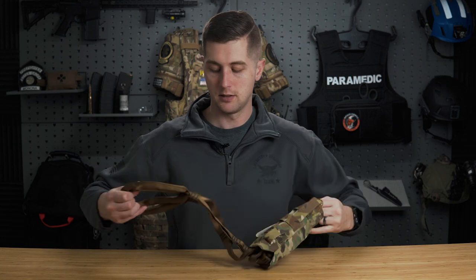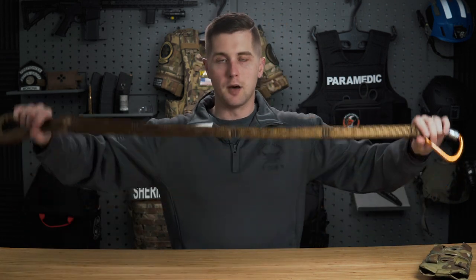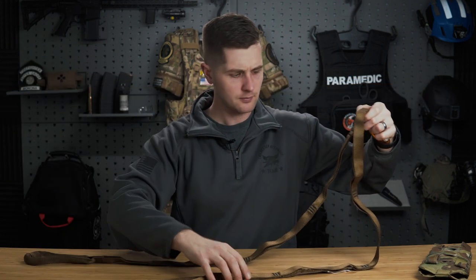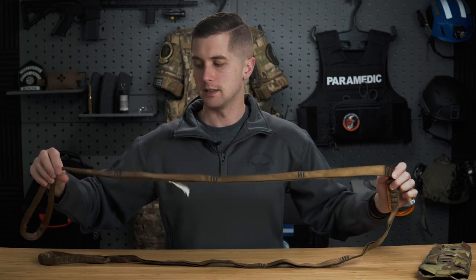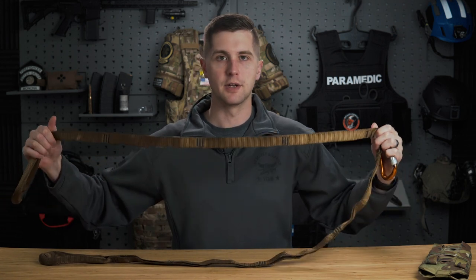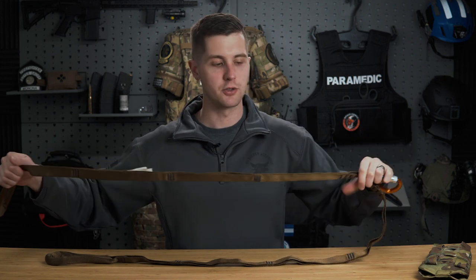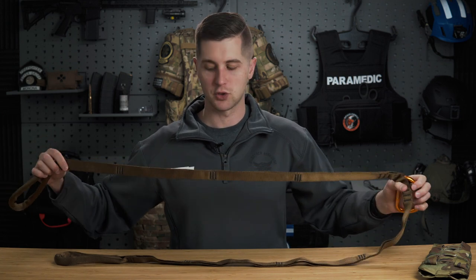As we pull this out, you'll see this loop is about seven feet long end to end. It's really thick — one-inch tubular nylon — and it is climbing rated. You're never going to break this. Even with your biggest patient in full tactical gear, this is not something that is going to fail on you.